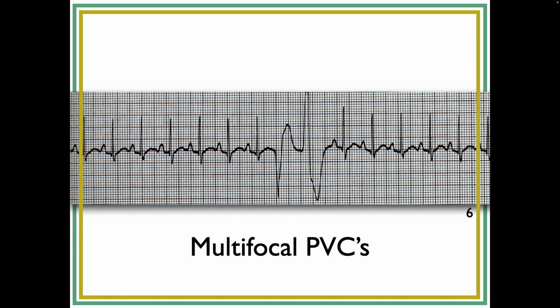Okay, everybody see that? So this one, my guess is that it originates near the bottom of the ventricles because the QRS is negative, so moving away from lead 2. So the ventricles are depolarizing from bottom to top. But this one, probably the ectopic focus is up near the top of the ventricles, and the wave of depolarization is moving toward lead 2. And so that's why we have a positive QRS.